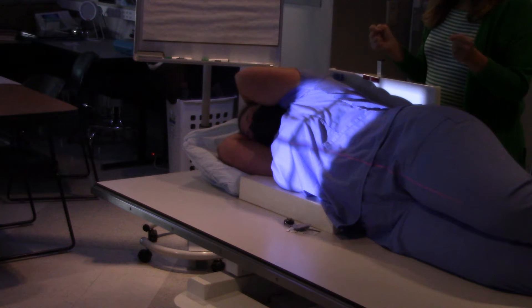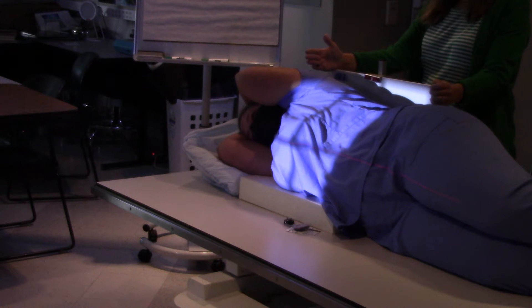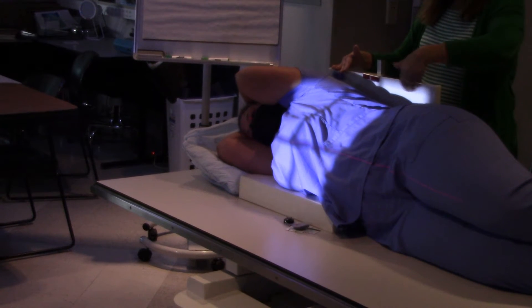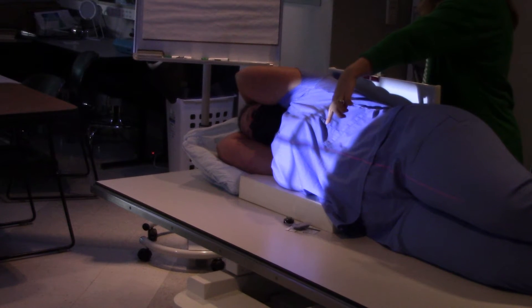If you get the collimation set up first — knowing that you want an inch and a half above the shoulders — then you can just follow it to midline. Now the light matches up here. You've got the marker up here and you have some space. Do you have light on the sponge down there?